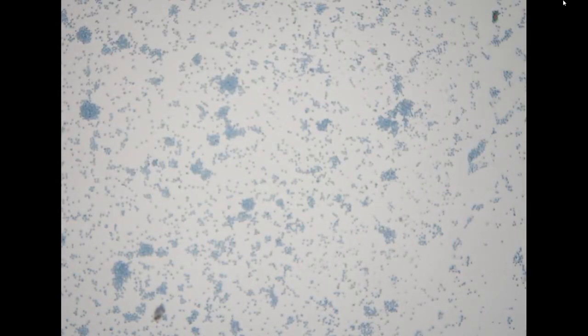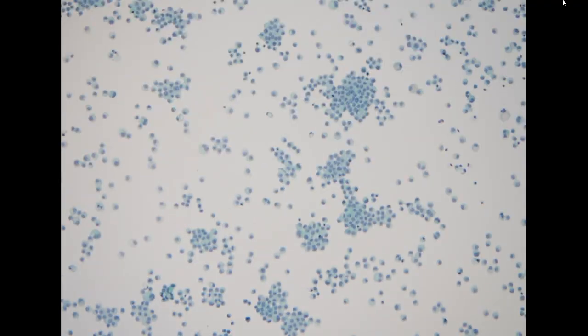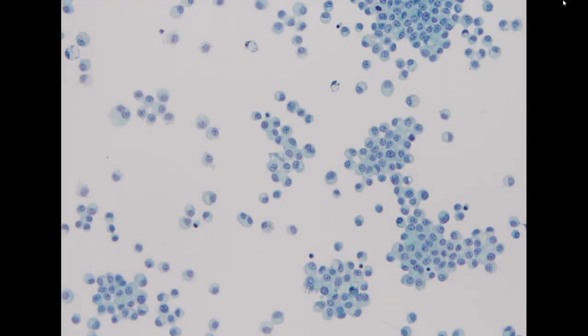So this is a CSF specimen, which is quite unusual to see so many cells in a CSF. So it is definitely not normal. Most of the cells are arranged as single cells, or loosely attached to each other.